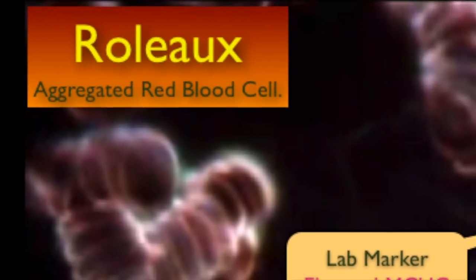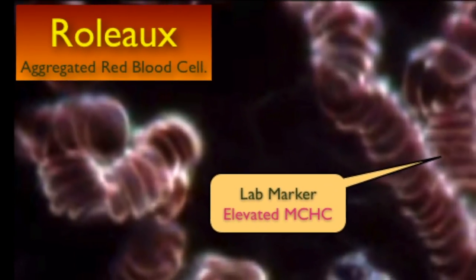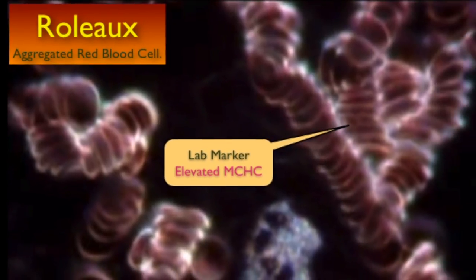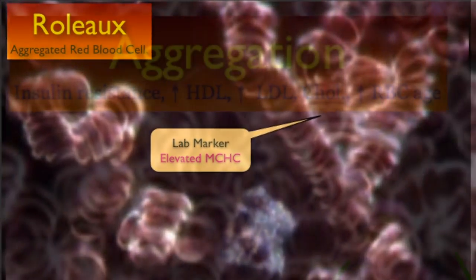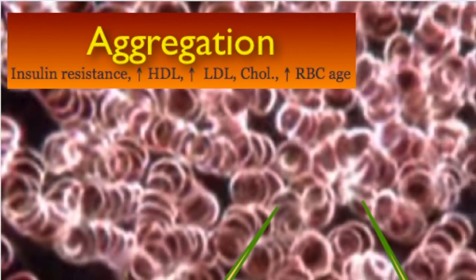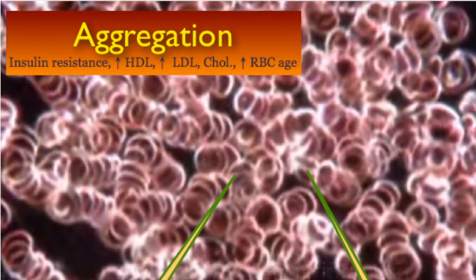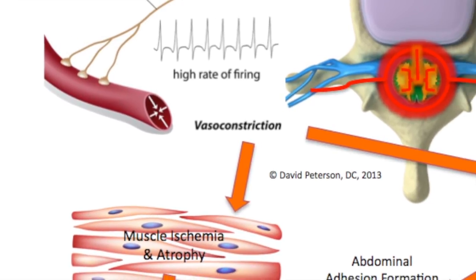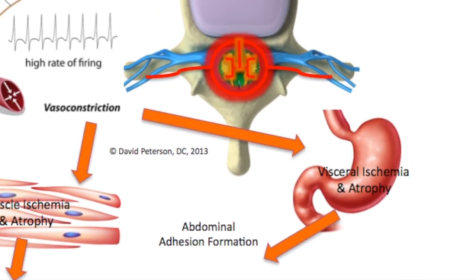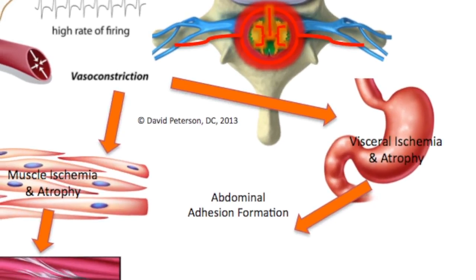Red blood cell clumping or sticking together occurs in different levels of reversibility. Rouleau formations are the most reversible, and restoration of blood flow breaks them apart. Aggregation occurs with larger rouleau formation. Decreased blood flow, associated with vasomotor ischemia, and increased fibrinogen diminishes the red blood cell aggregation's ability to break up, even when blood flow increases.